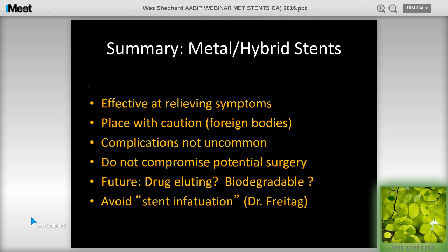So it's rigid bronchoscopy, and without going into too much of the technical detail, a standard technique of using the bevel of the rigid bronchoscope to begin to pry the proximal edge and free up the proximal edge of the stent from the airway wall, using forceps to gently probe the stent out of the lumen and try to separate it from the wall. There's obviously a lot of other technical techniques that we're not going to be able to get into in the conversation.